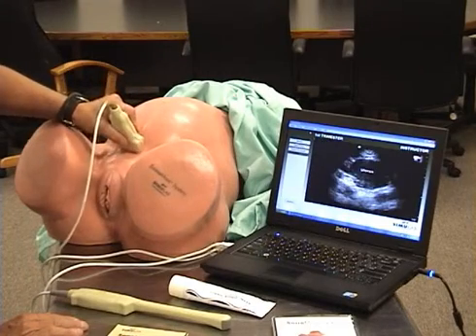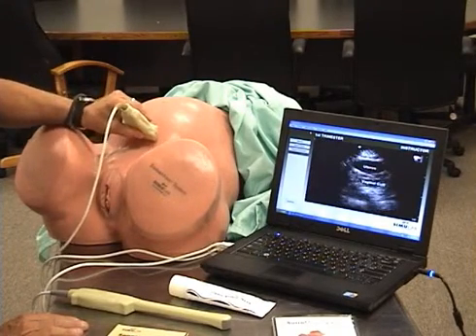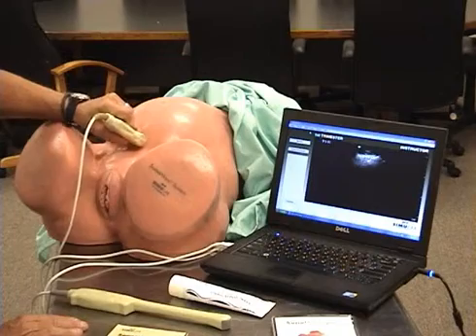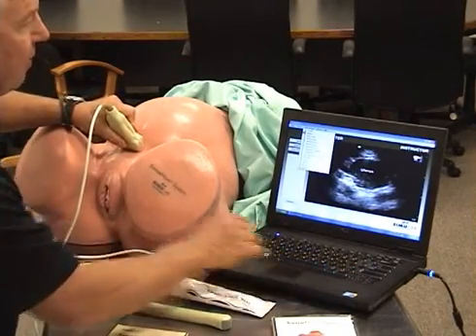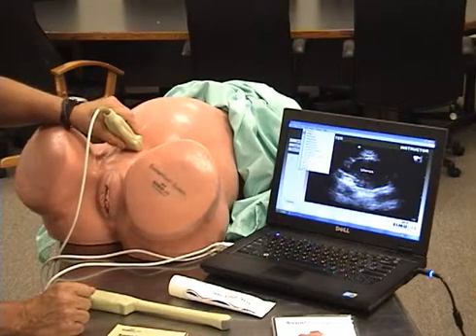So what I'm showing here is actually in the target zone for showing an ectopic pregnancy. And as you'll notice here in the patient library, I have ectopic number 2 shown as an abnormal patient.